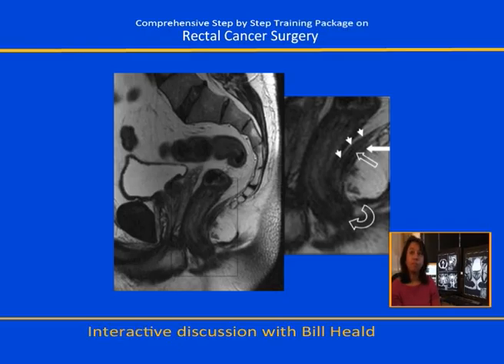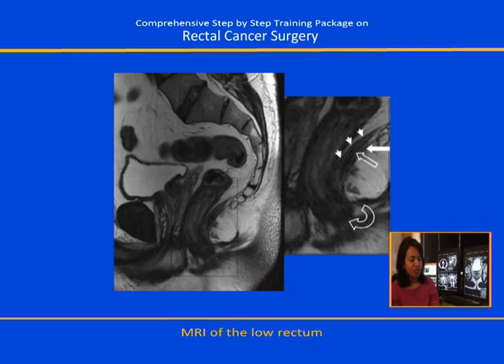It is important. And one of the things about low rec is that each of us is separately going to record on our proformas the height we assess as being the lower margin of the tumour. Right. That's right. It's unusual to find a major discrepancy, I have to say, from all the experience that we have in the MDT, and generally the important aspect, which is the relationship of the tumour to that very crucial landmark, the puborectalis sling, we can come to an agreement about that relationship, and therefore the decision about which plane is safe can be made ahead of the theatre.